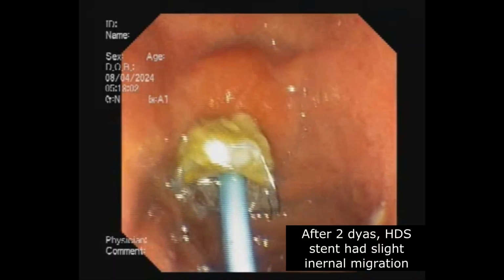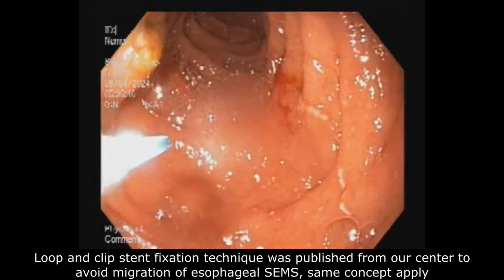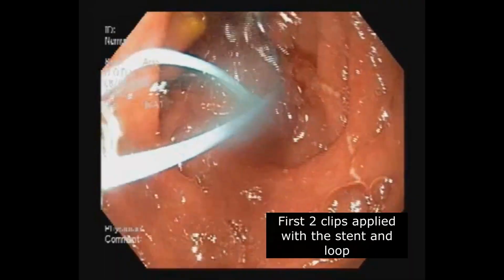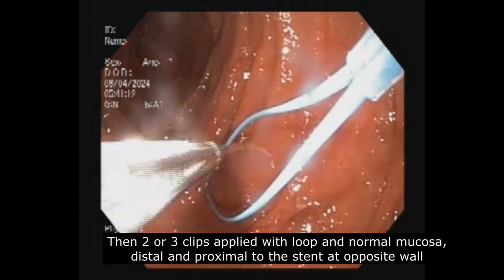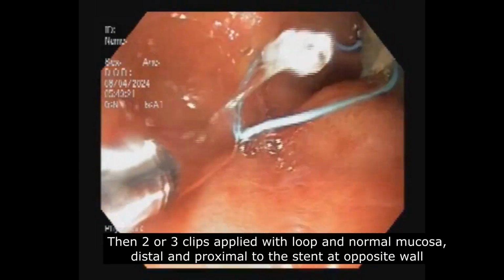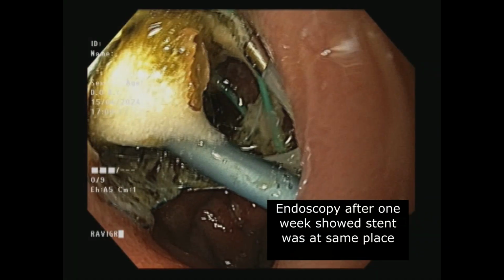After 2 days, the HDS stent had slight internal migration. A loop and clip stent fixation technique was published from our center to avoid migration of esophageal SEMS. The same concept was applied here. First 2 clips were applied between the stent and the loop. Then a few clips were applied between the loop and the normal mucosa. Endoscopy after 1 week did not show any stent migration.